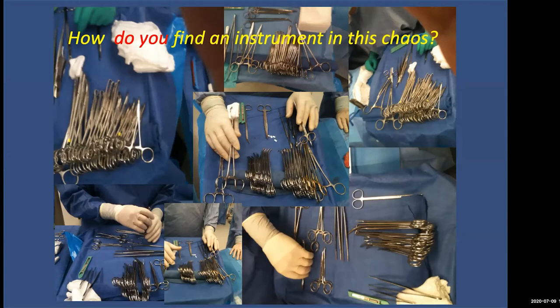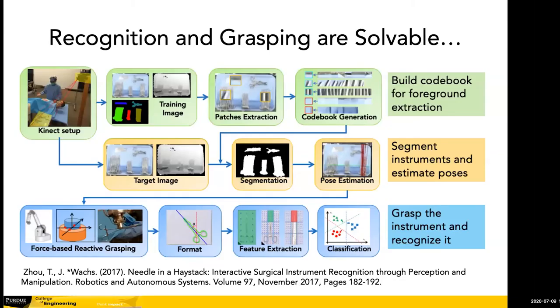So how do we actually deal with this problem? It turns out there are a lot of computer vision and grasping challenges, but I'm going to claim that those are solvable. With enough technical work and research, you can deal with some of those problems. You can use fancy computer vision and pattern recognition techniques to recognize the different tools and their position and orientation, and adapt the tool tip or end effector of the robot to the orientation of the instrument, using different types of actuation, for example electromagnetic force, to grasp the instrument. And we were able to succeed pretty well with this problem.